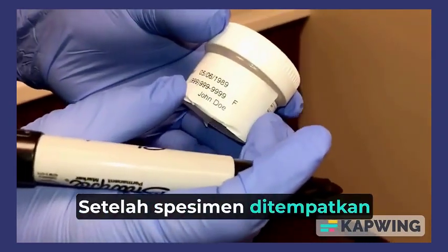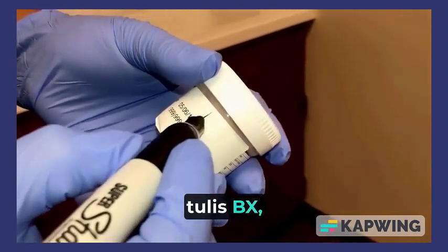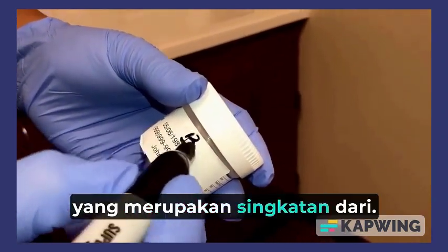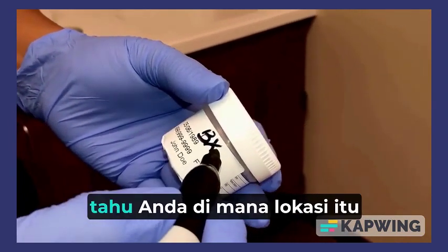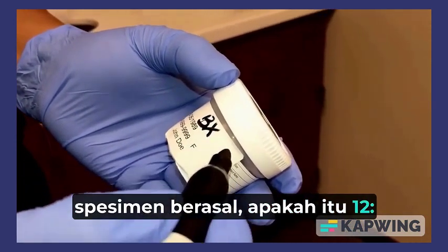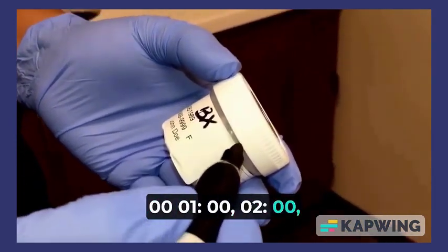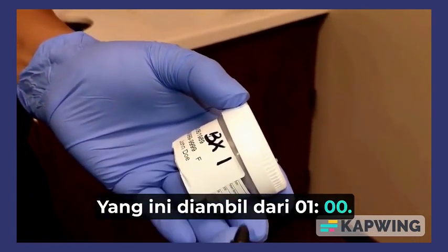After the specimen is placed into the vial, you will then have to write BX, which stands for biopsy, and the provider will tell you where the location of that specimen came from, whether it's 12 o'clock, 1 o'clock, 2 o'clock, etc. This one was taken off of 1 o'clock.